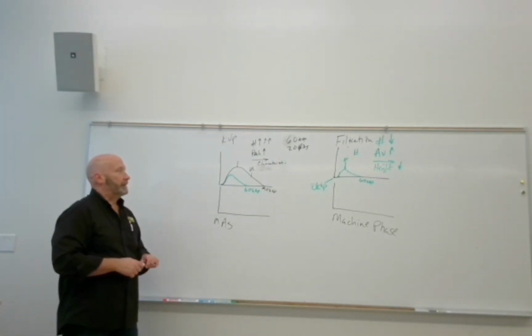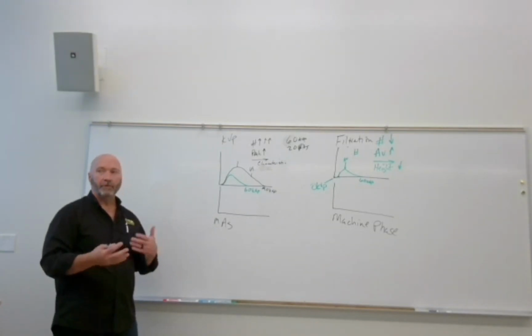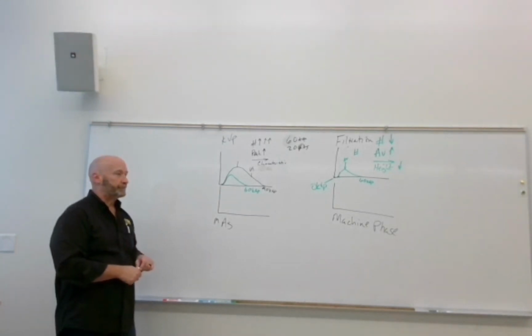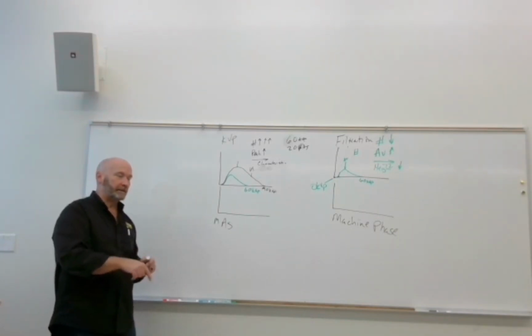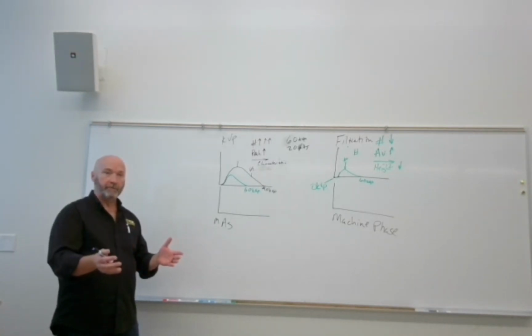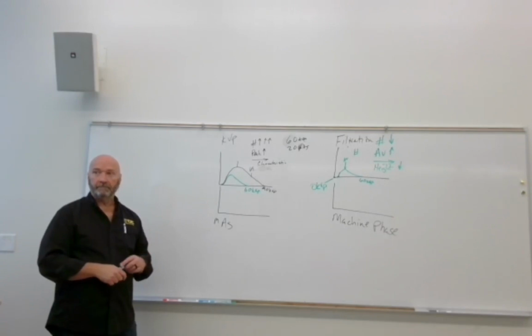So kVp, since it doesn't affect contrast anymore, I do believe that you're going to start seeing more change in kVp. And actually, I think you've seen that a little bit. Patient size, for example. If you push the button that says you're shooting an asthenic patient, and you pay attention to what it's giving you as far as kVp goes, then you push hypersthenic patient, you're probably going to see an adjustment in kVp, right?